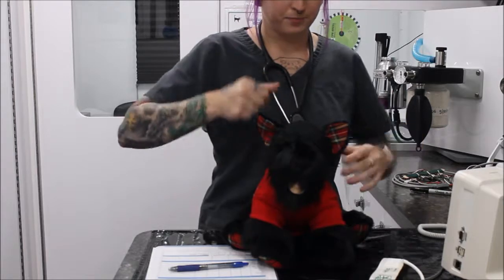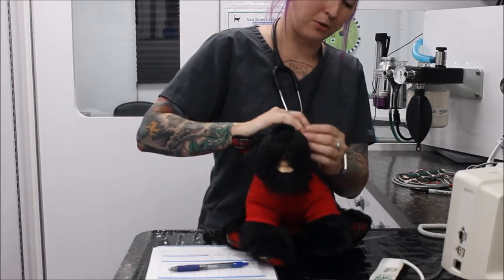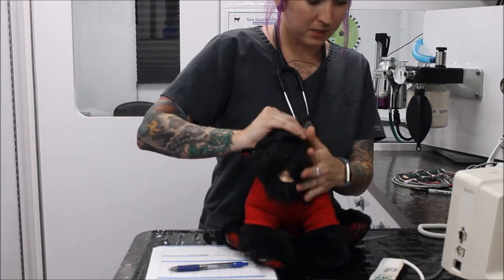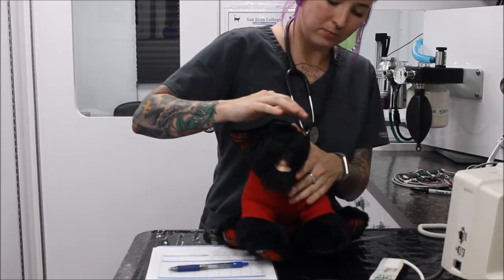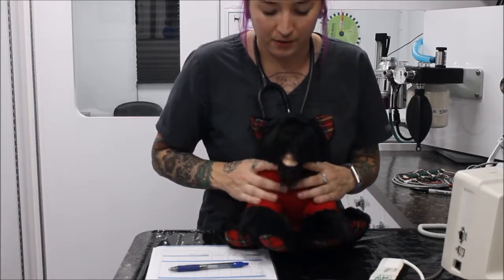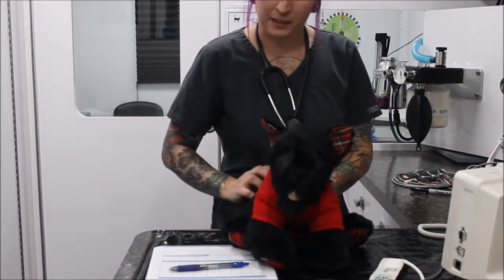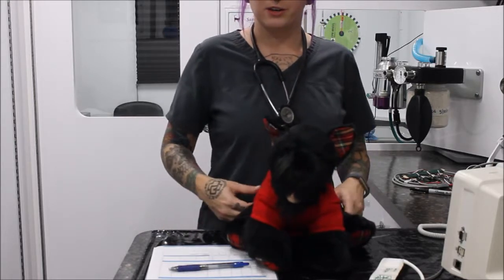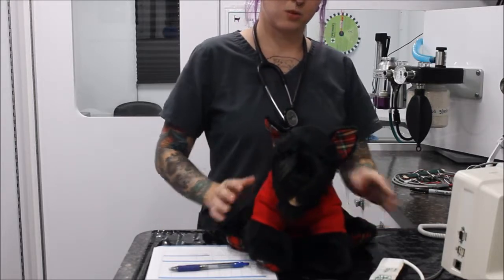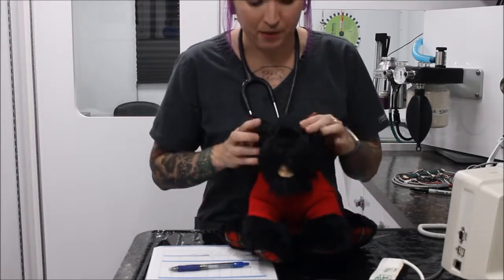And then if they are perhaps too light or too deep, we can see their eyes will be in central position. Usually if they're in central position and they're pretty deep, we don't like that, so at that point you can intervene. Like I said, it's important to monitor those eye patterns.